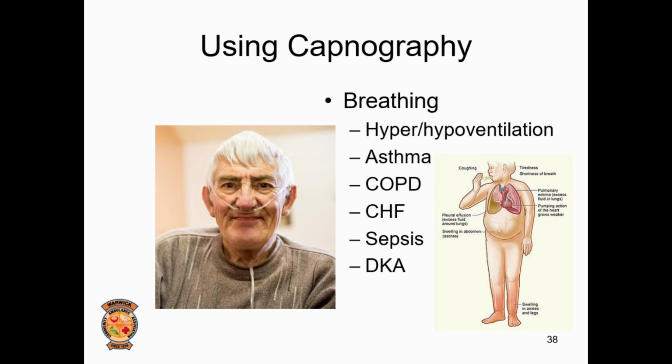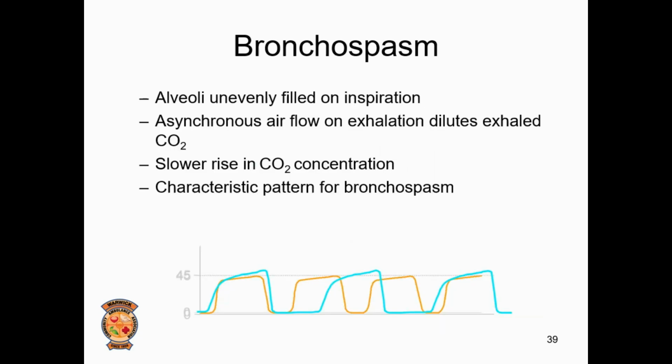Capnography plays a big role in our diagnosis of bronchospasm. As we know, bronchospasm is the uneven filling of alveoli during inspiration and the uneven emptying of alveoli during exhalation. This causes a characteristic shark fin waveform on the capnogram.